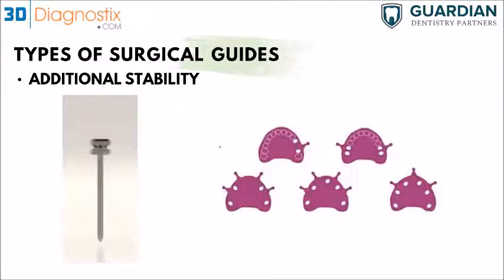And of course, on the bottom here, those are examples of tissue-supported and bone-supported guides. We're always going to have to use fixation pins in those two types of surgical guides. And we would recommend at least 4 fixation pins to be evenly distributed. And that is just to make sure that the guide is seated all the way from left to right side.